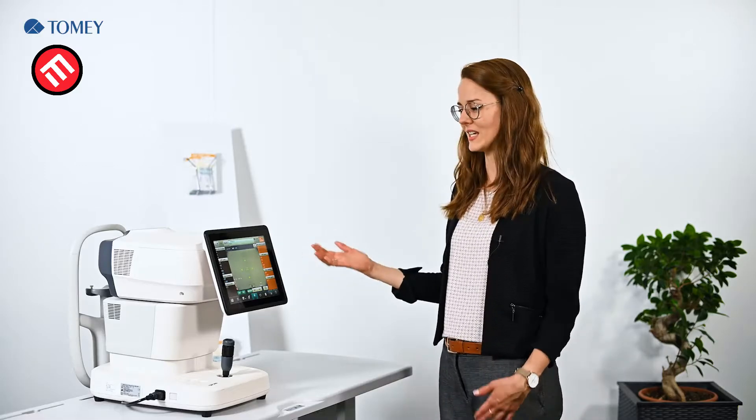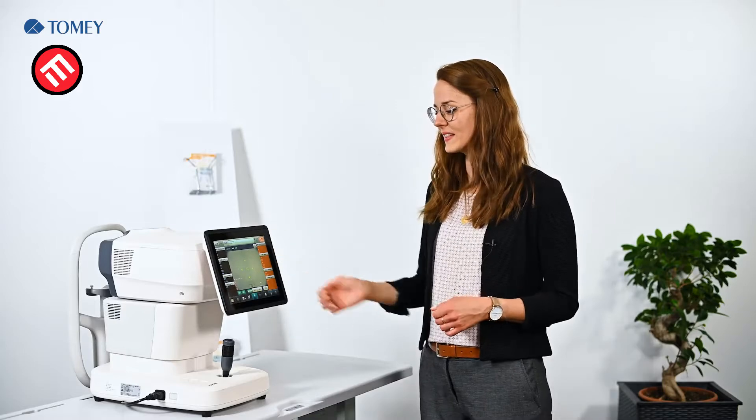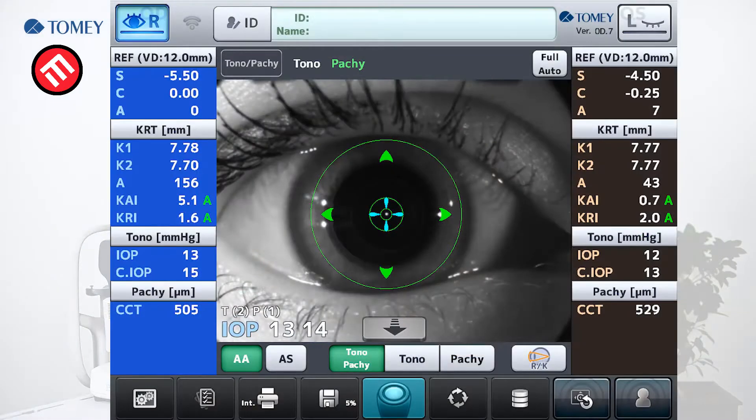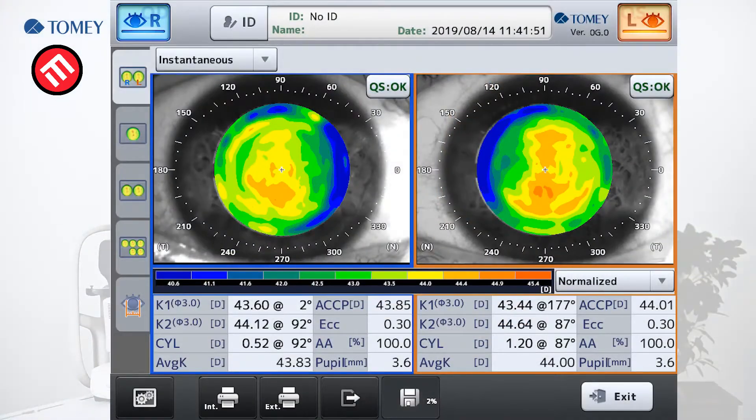This unit combines a lot of systems. You can use it as an autoref keratometer because it has autorefraction and keratometry measurement functions. Also included is a tonometer which includes pachymetry, so you will get the IOP and also a corrected IOP which takes the thickness of the cornea into account. The third function is a topographer, so you will get a corneal map which you can analyze afterwards, for example for contact lens fitting.